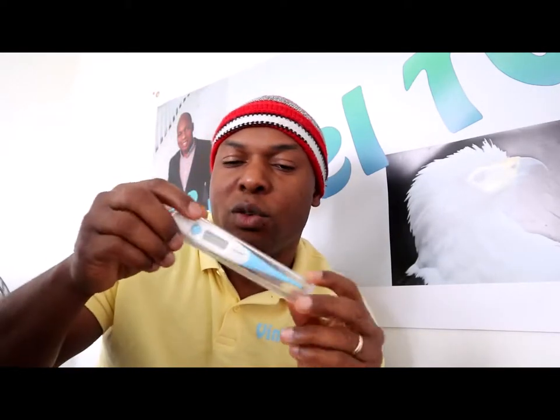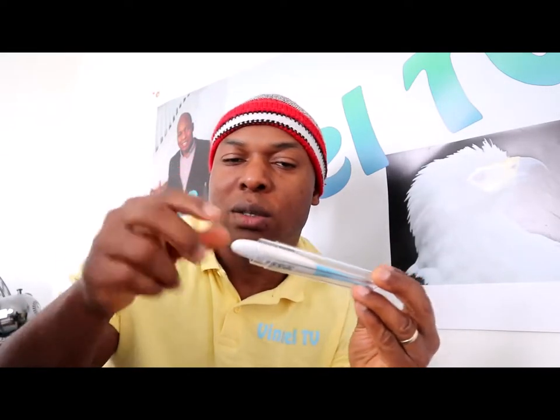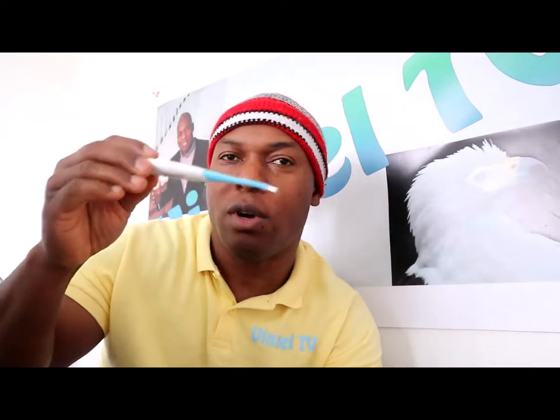I want to show you this equipment. This instrument is a thermometer probe. It's what we use to measure our body temperature. We use this gadget to measure the core body temperature. You can measure it underneath your tongue. This one is called a thermometer probe. Underneath your tongue or underneath your armpit.